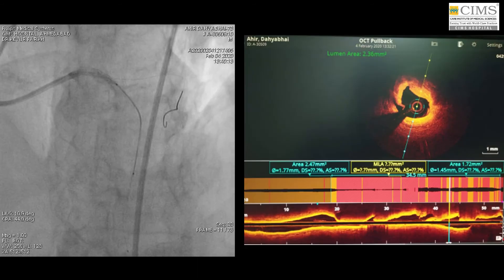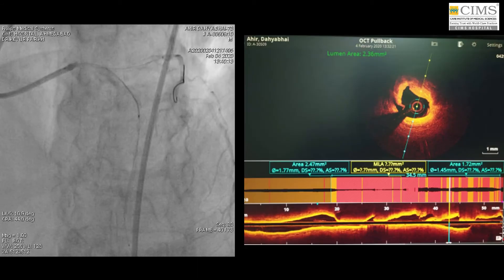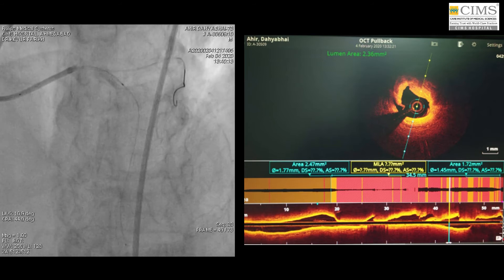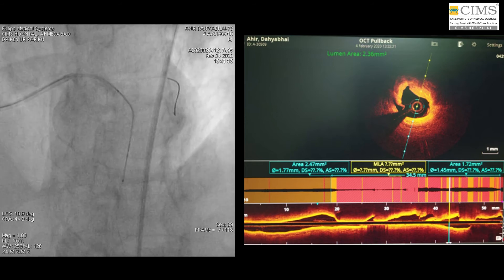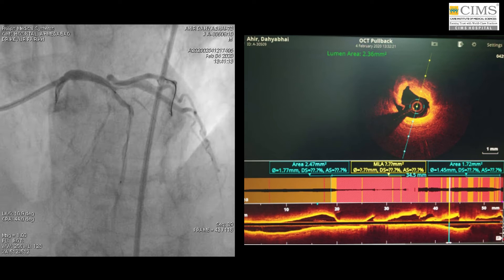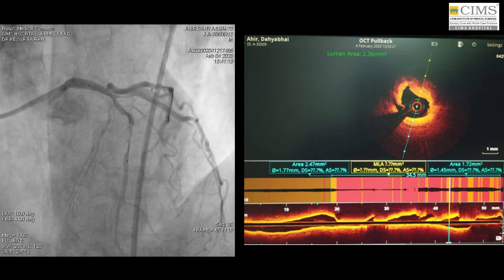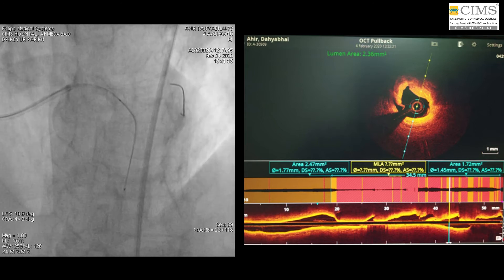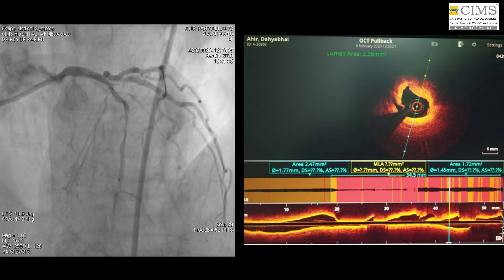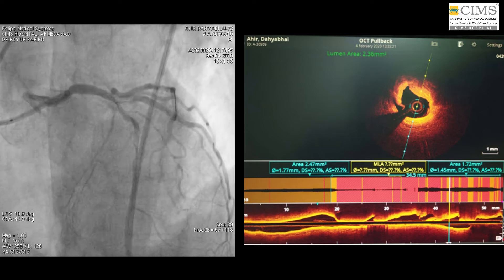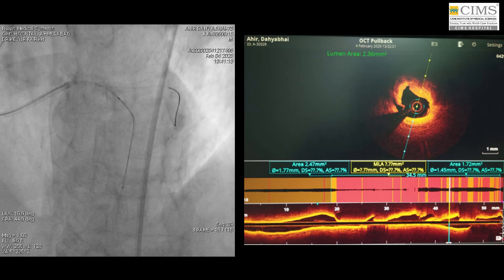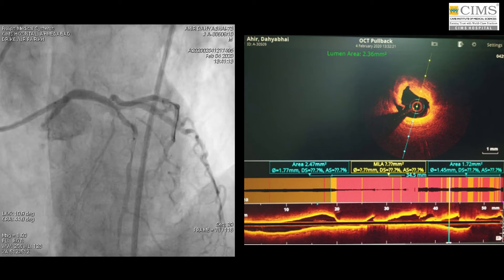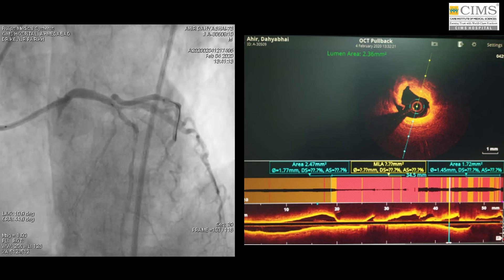As we go further, you can see this OCT image with a longitudinal section of the arterial wall shown below. What OCT does is tell us the actual length of the artery which needs stenting, the morphology and structure of the arterial wall, what the block is made up of, and how much calcium and other abnormalities are present — so that you can plan your intervention for the best possible outcome. The images are so clear and crisp that you can make out very easily what the arterial wall is made up of.